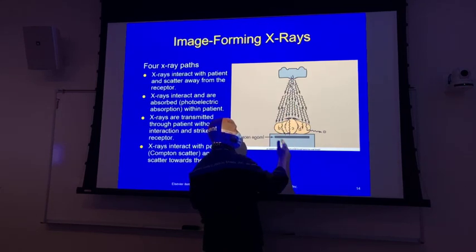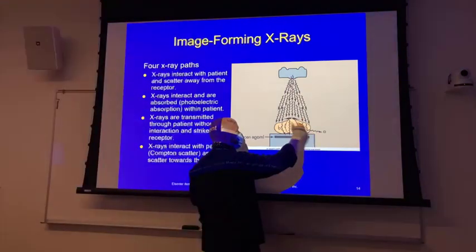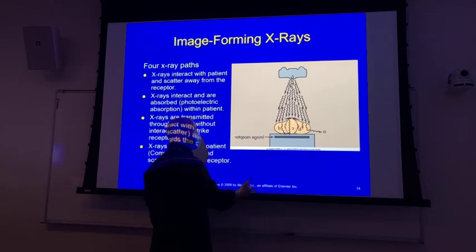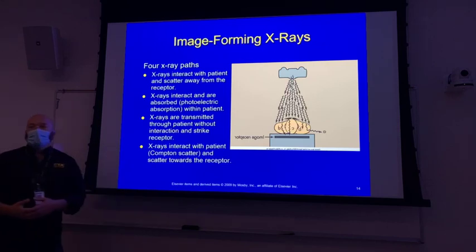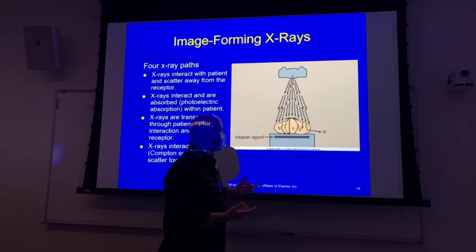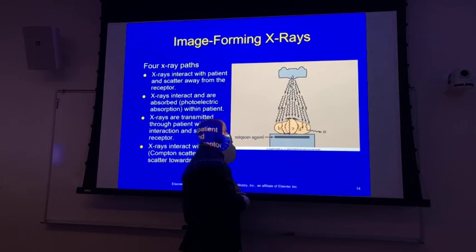So what we're looking at here in all of these, both of these, is transmission of a Compton photon, right? So even though this one doesn't scatter off at a very steep angle, it's still a steeper angle than the straight transmission, right? So the patient's dose comes from both the partial absorption of that photon, but also significantly from the total absorption of the photon.